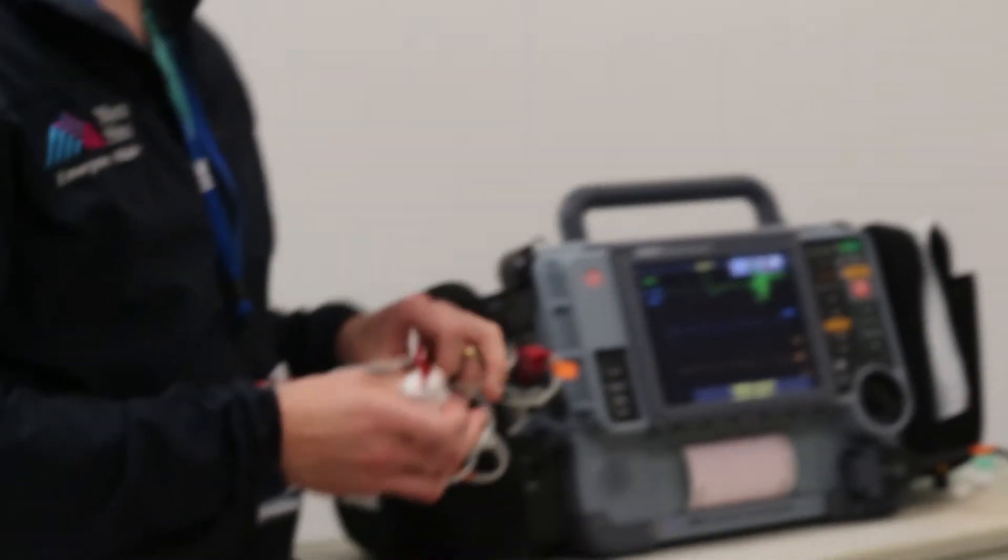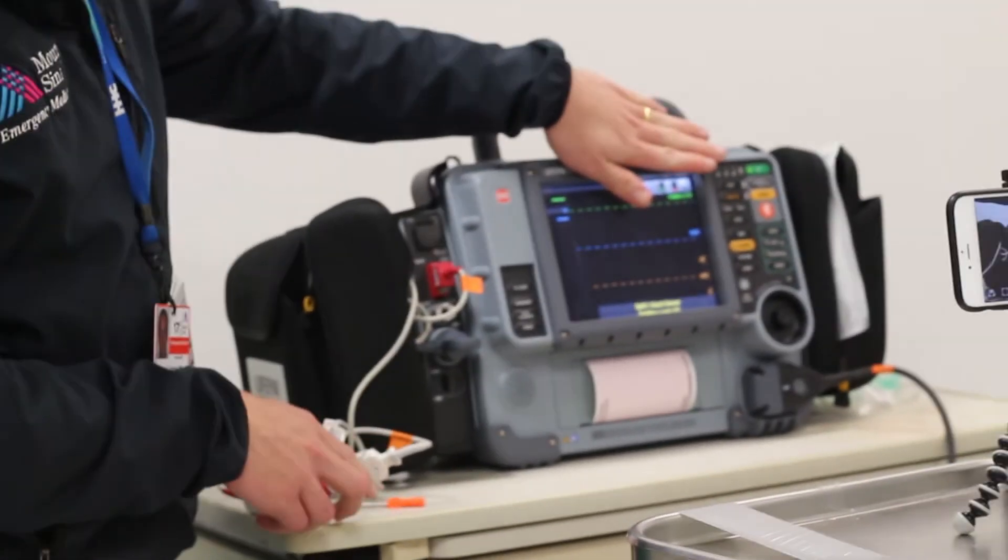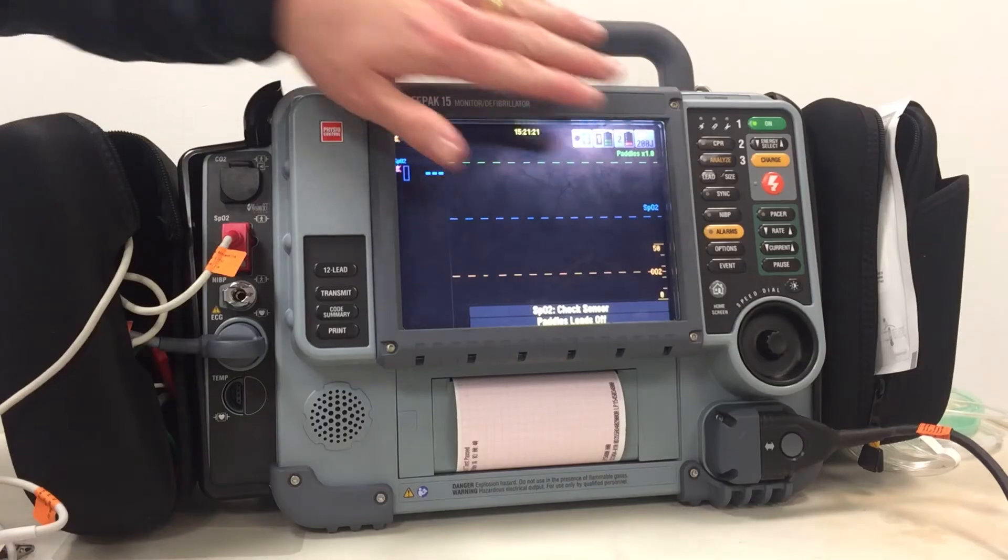The monitor is also able to monitor pulse oximetry. As soon as you put this on the patient, it's going to come up on the monitor's screen.